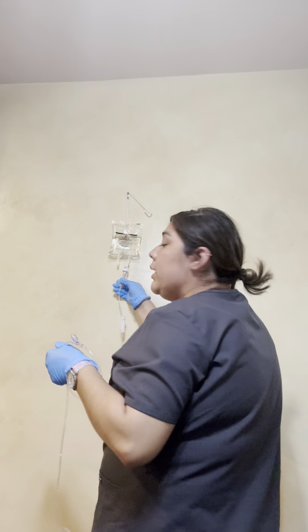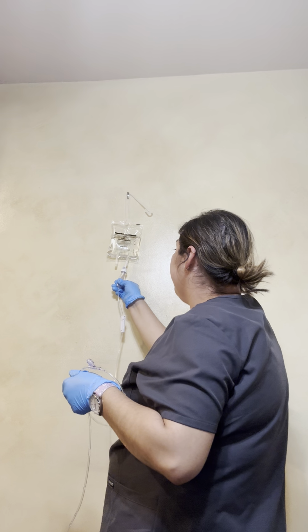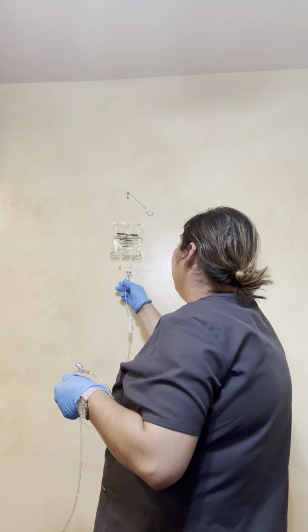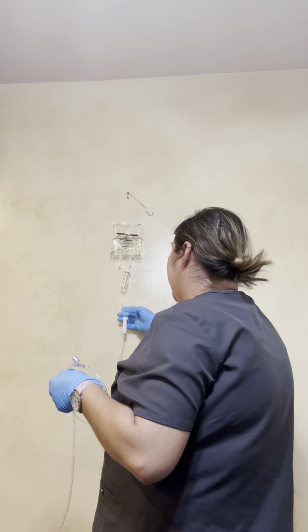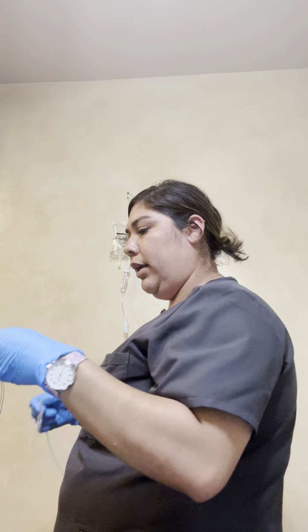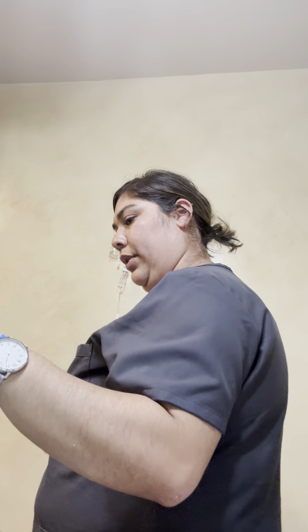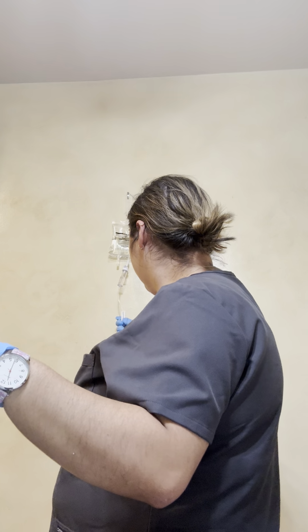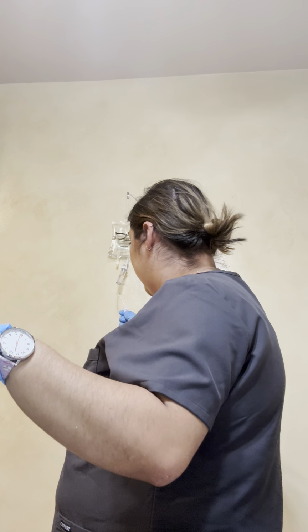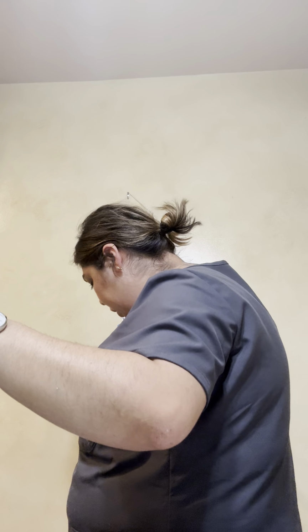We're gonna go ahead and squeeze that chamber just to where it's about halfway. There we go, that's about halfway. So now we're gonna go ahead and start priming our tubing before we calculate our drip rate. So I'm gonna use the roller clamp. I'm gonna unroll that up to prime this.